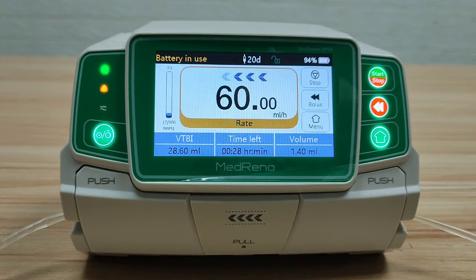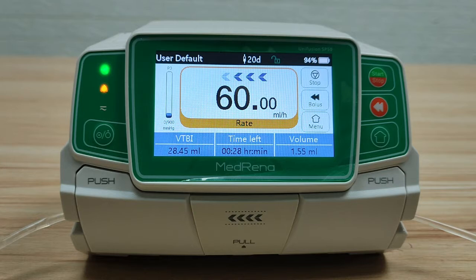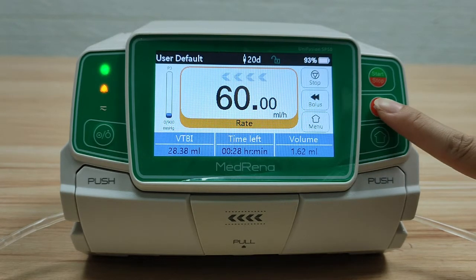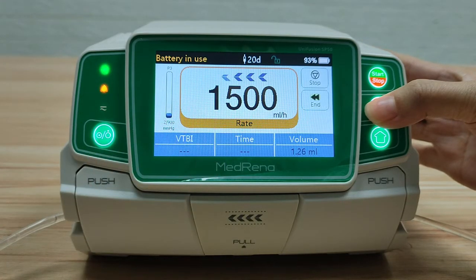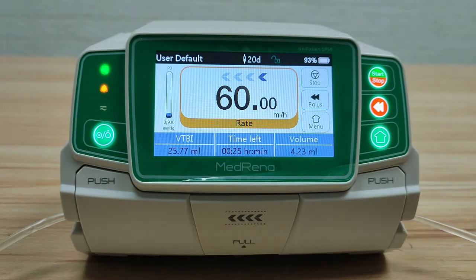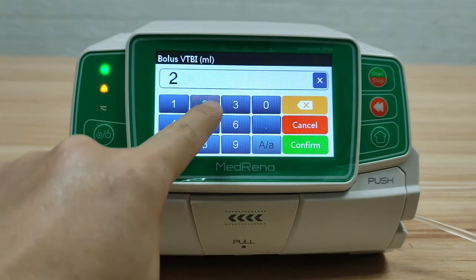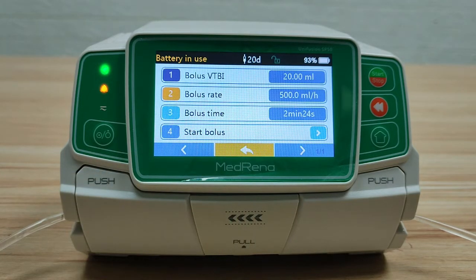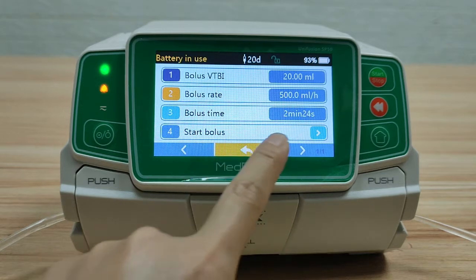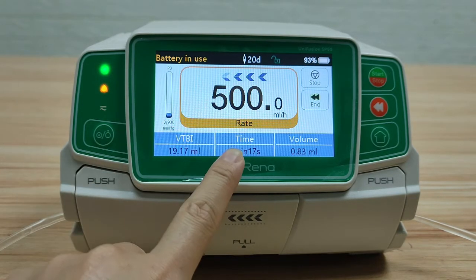If you need to infuse a large volume of medication within a short time, use the bolus function. Either manual bolus or automatic bolus is available. Manual bolus is performed by keeping the bolus button pressed on the side; the bolus rate is the maximum flow rate. Release the button to stop the bolus. For automatic bolus, press Bolus on the screen, enter the bolus VTBI and bolus rate — for example 500 mL/hr. The pump automatically calculates the bolus time. Press Start Bolus; the bolus will stop automatically after the set duration.